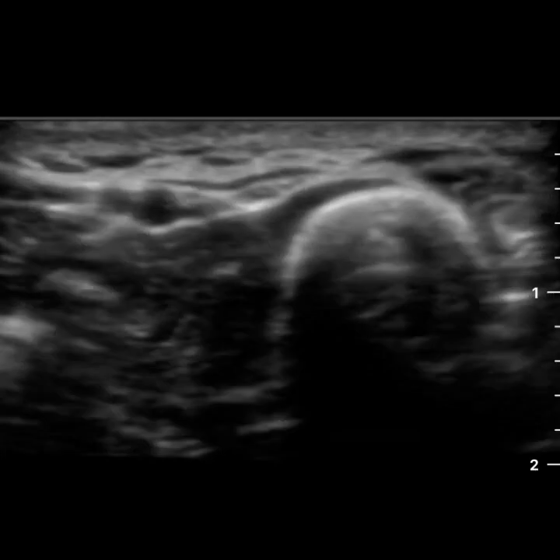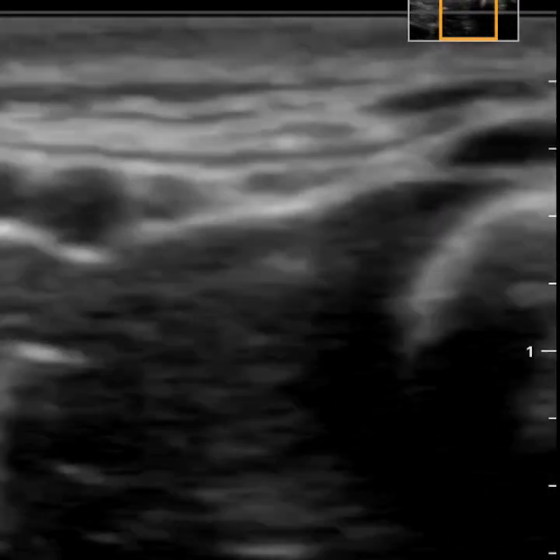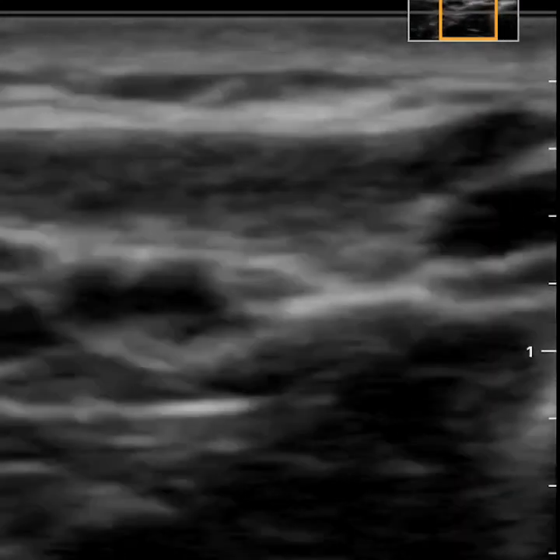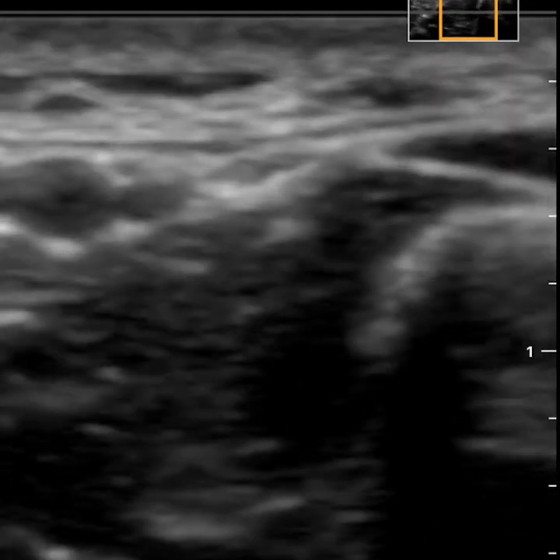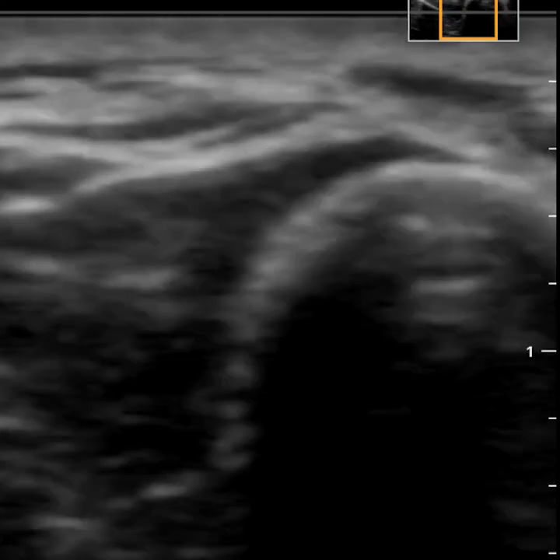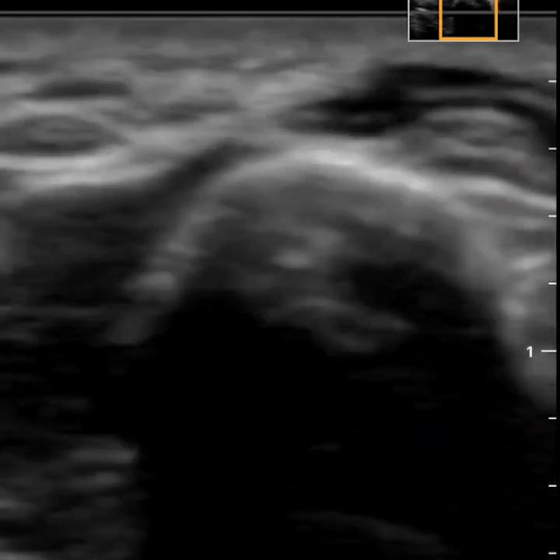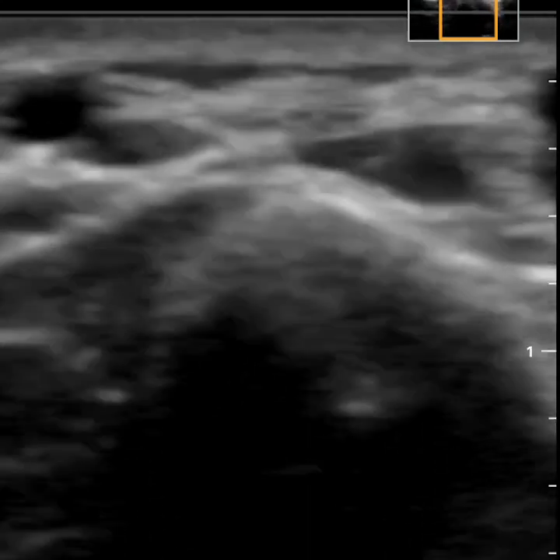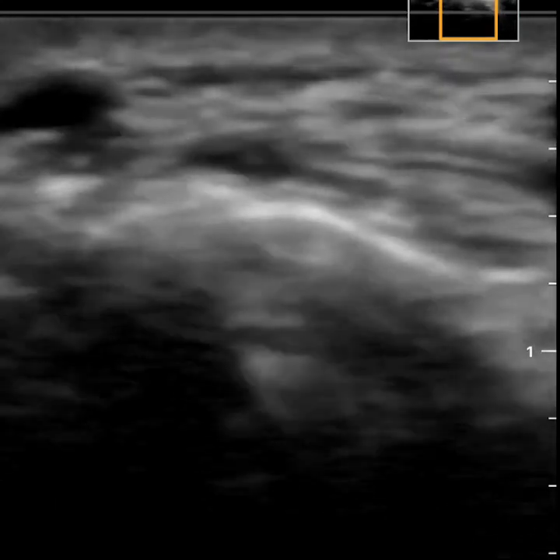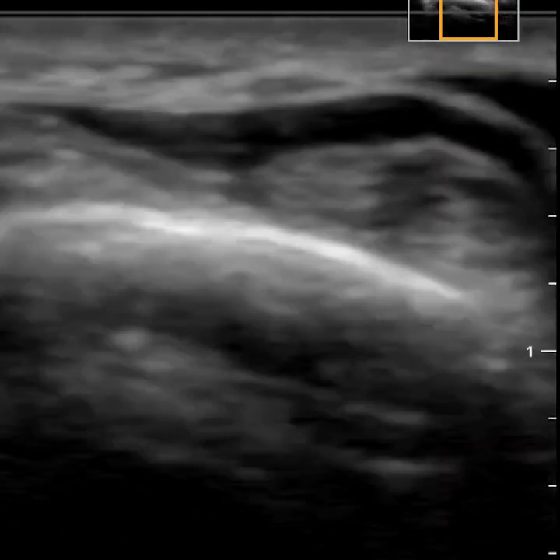I started to play around with it to see if the zoom function was also helpful. I zoomed in and in the top right corner you can see the little thumbnail. Zooming really doesn't do anything for the grayscale image — the dynamic range doesn't change at all, and it's not really helpful for those sub-centimeter lesions or structures you're looking at.